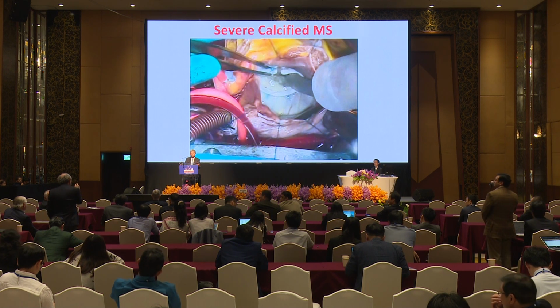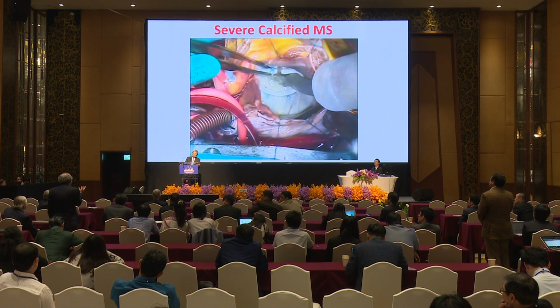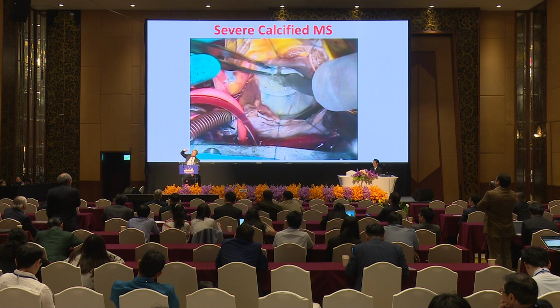So do you think that the Gore-Tex or artificial chorda you implanted on the posterior are longer than the secondary chorda? I mean, if the secondary chorda are normal, why should we resect them? Usually when we resect, we see the pathology is thickened, shortened and angulated, and disturbs the normal configuration of the leaflet. Then we are not reluctant to cut it.